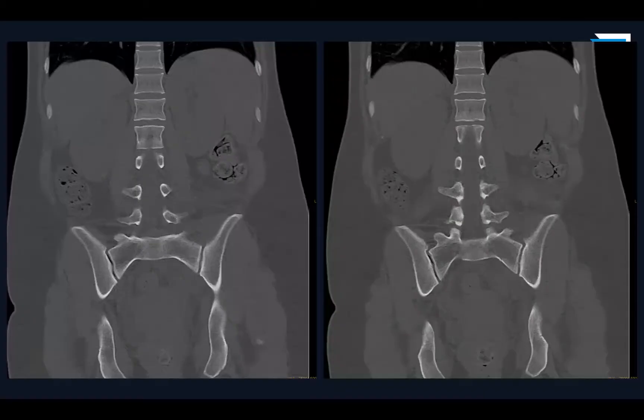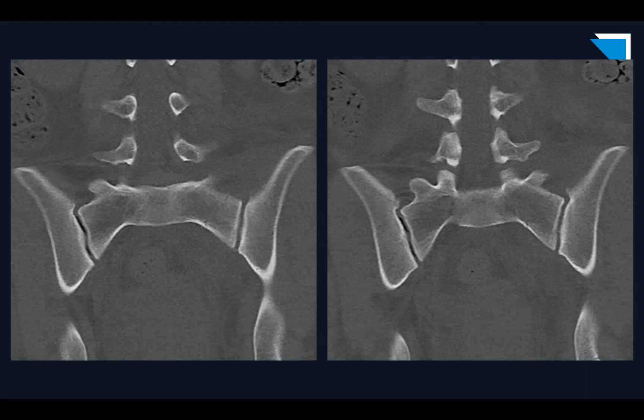Now let's look at the coronal reformats. Perhaps you can see it — we can zoom in and put a blue arrow on it. And there is your oblique non-displaced left sacral stress fracture, which Dr. Garcia spotted as the cause of all that retroperitoneal edema and hematoma.